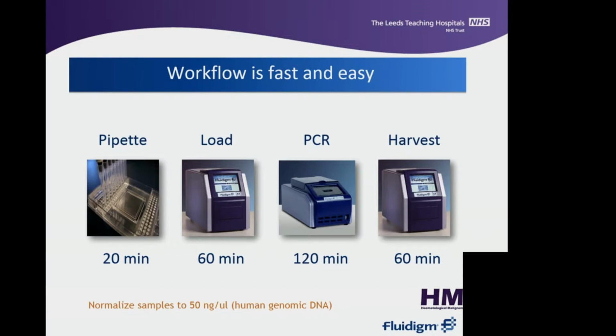24 hours on a MiSeq, so actually hands-on time is 2.5 hours. Actual time from preparing, it's a normal working day. You can fit it in a 7-hour working day, and you sequence overnight. We run this system every single week. We run it on a Wednesday usually, and we report on a Monday. So the turnaround time for our 48 samples is usually 7 days.